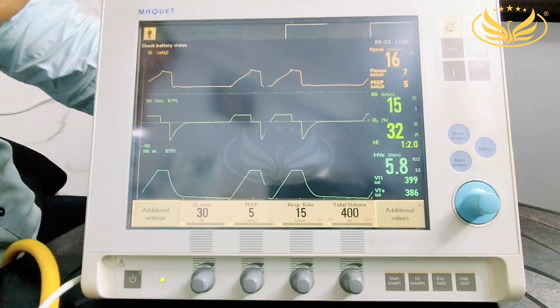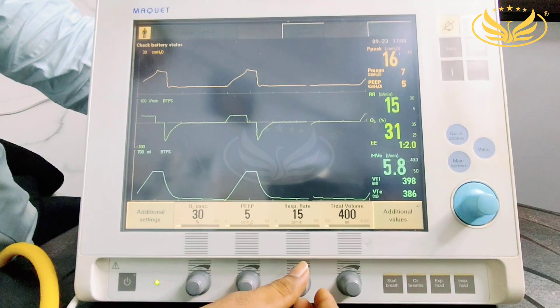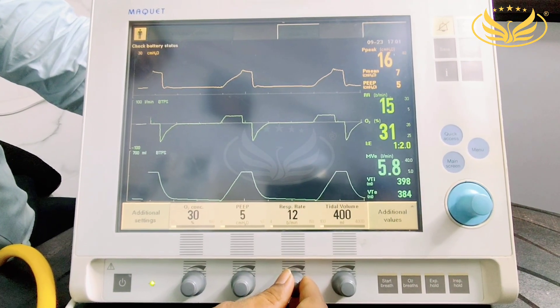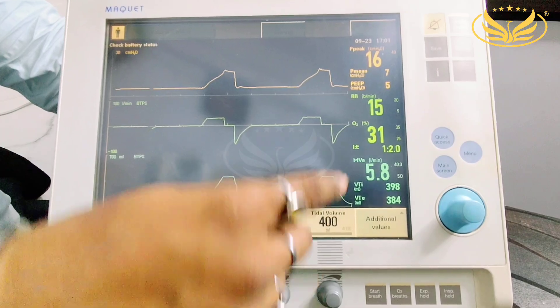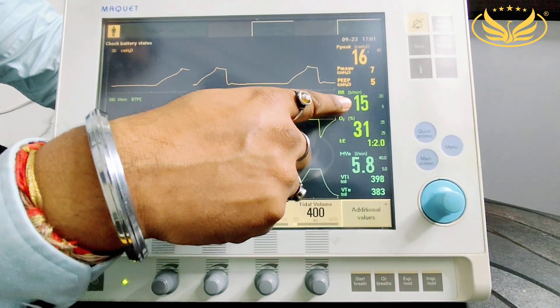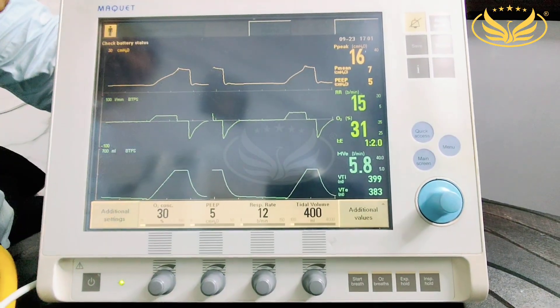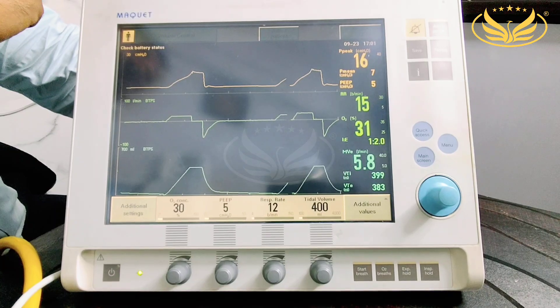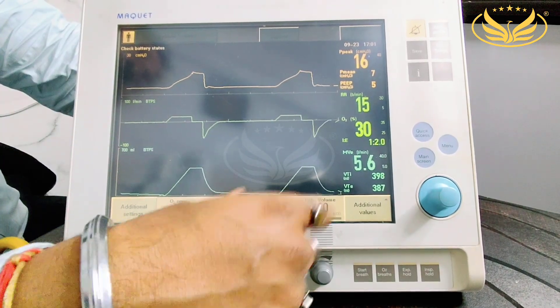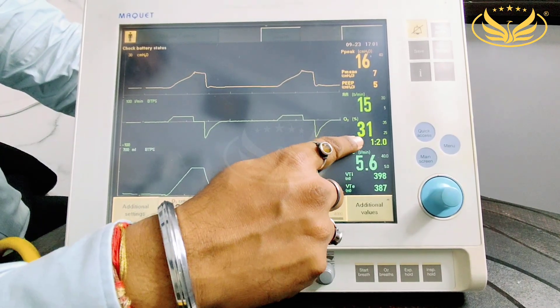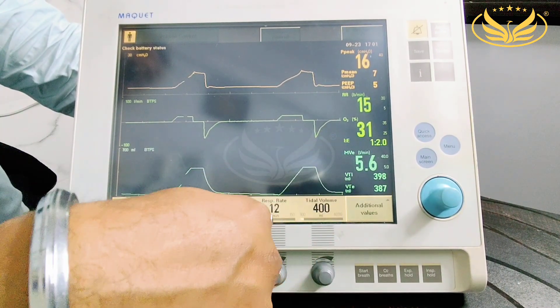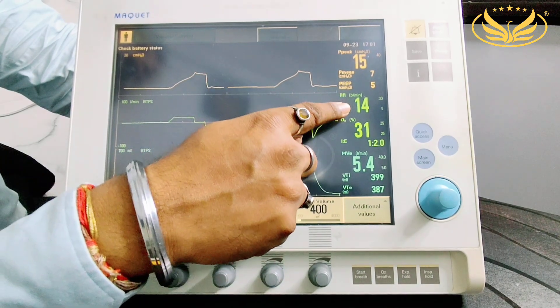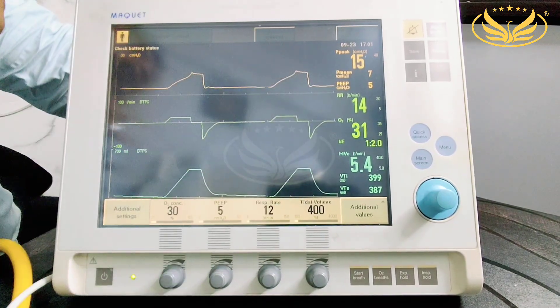RR is 15 — that is respiratory rate. Suppose if I want to decrease the respiratory rate to 12, the moment you set 12, the RR of the patient will get reduced. We have kept 30% O2 and RR 12, both have been achieved, and you can see the RR is getting reduced accordingly.